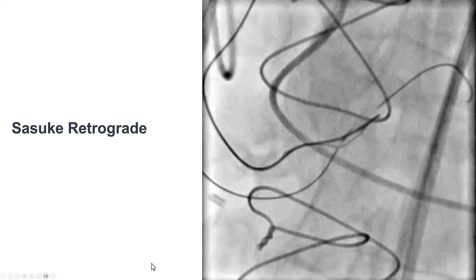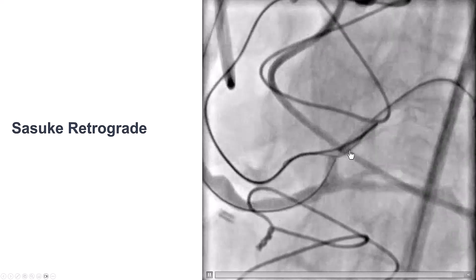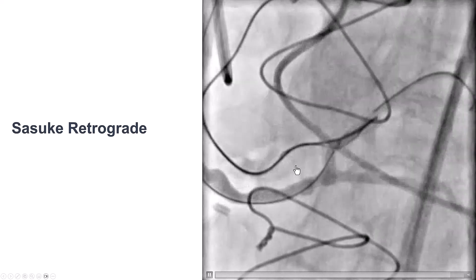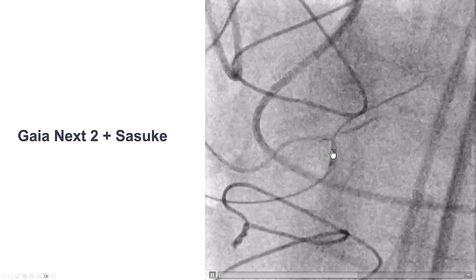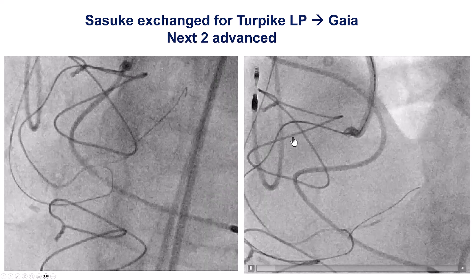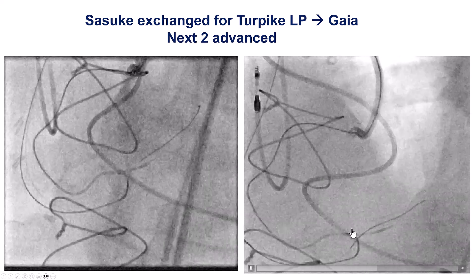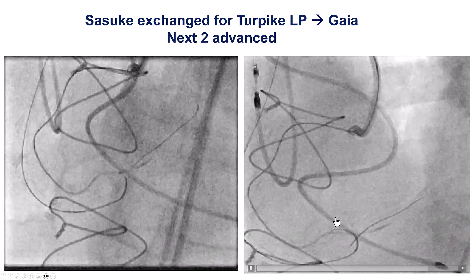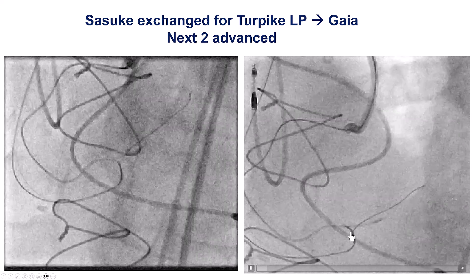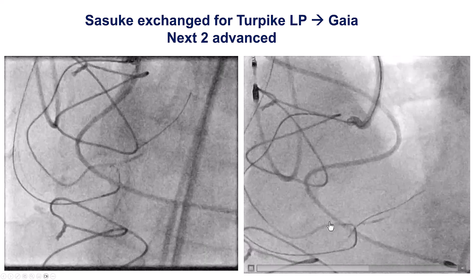So the plan was to switch to retrograde. We advanced a guide wire into the posterior lateral. We noted that the antegrade knuckle had advanced a little too far into the posterior lateral — which would become important later. We used a dual-lumen microcatheter, the Sasuke, trying to direct the retrograde guide wire towards the distal RCA. Using a Gaia NEX2, we made the bend across the bifurcation of the PDA and the right posterior lateral, then switched to a standard Turnpike LP microcatheter. We were then able to direct the Gaia NEX2 next to the antegrade guide wire, with retrograde and antegrade wires now overlapping inside the occluded segment of the distal right coronary artery.